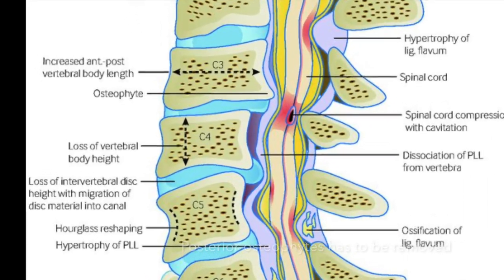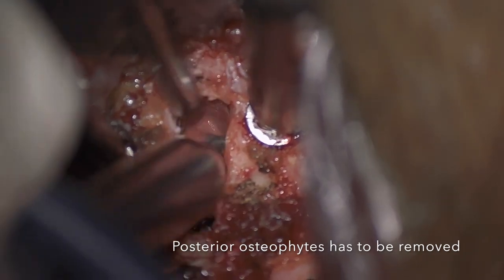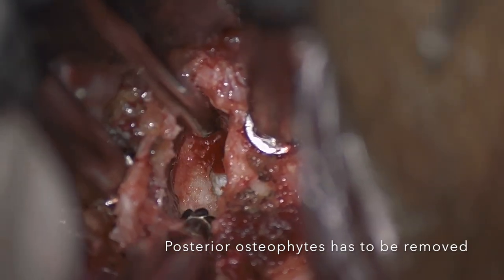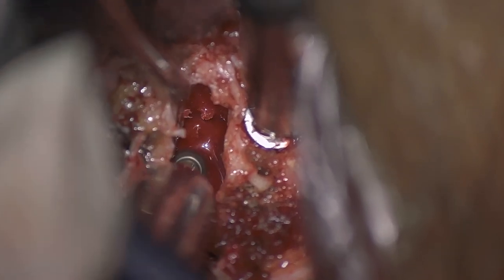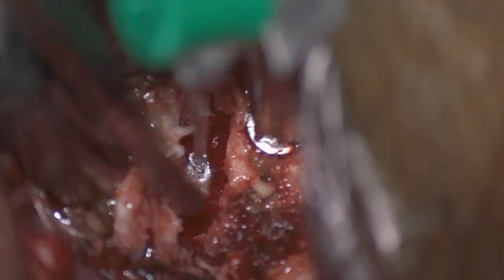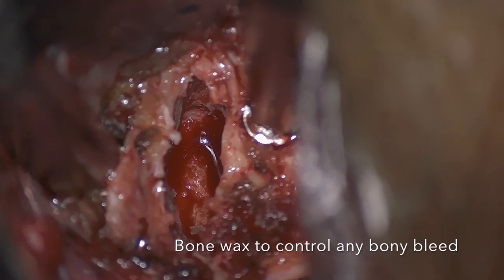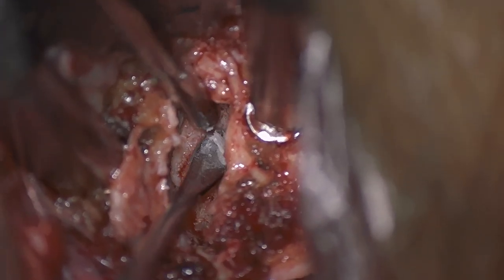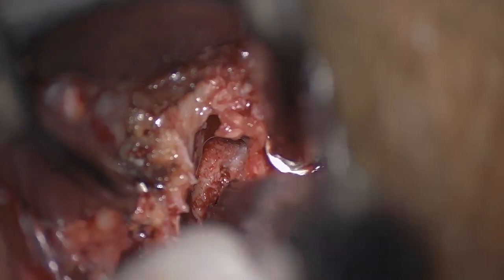Once the disc space has been completely burred out, the next step is to look for posterior osteophytes. In these cases, the posterior osteophyte will obscure you from reaching the posterior longitudinal ligament. A high-speed burr can be used to remove the superior and inferior osteophytes. Any bony bleed encountered can be stopped using bone wax, which is an excellent tool to stop bony bleeds in these cases.